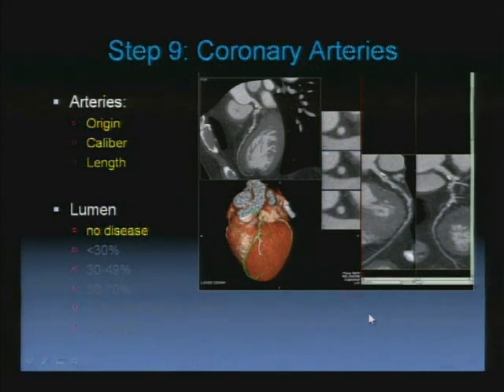And for some of you, you may decide that all you're going to describe, and it's a valid point, is to say CT is used for no disease, disease, or I can't tell. And if you do that, you're going to be right most of the time. But I would say to you that I think we're a bit better than that. But equally, I don't belong to the camp which will say this is 5% or 10%, 10% or 15%. I don't think we're that good. And you have to decide how you're going to approach this, but this is how we do it.